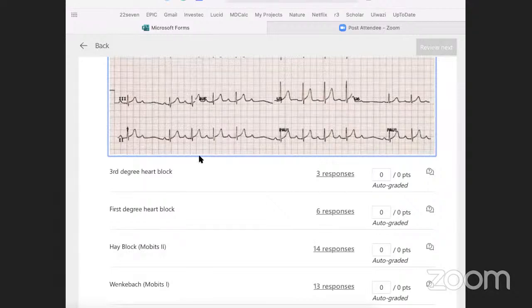And so it would be safe to send this patient home and have a sort of non-urgent or elective cardiac OPD. If this was a Mobitz 2, and I think a lot of the audience would be arguing that this is a fixed distance between the QRS complexes, that's a higher degree block, and it's likely that the patient could develop symptomatic bradycardia, and so they would need more urgent cardiac referral for pacemaker.